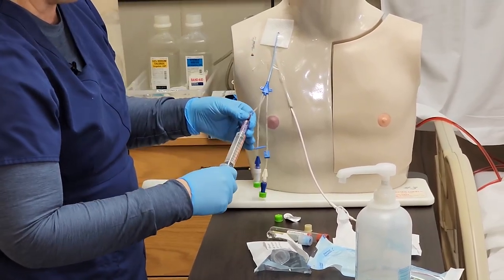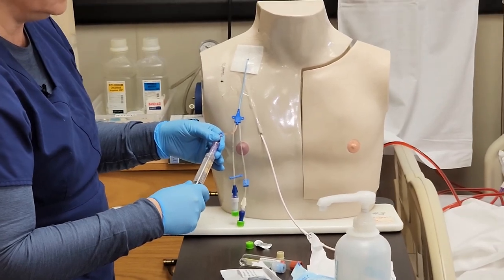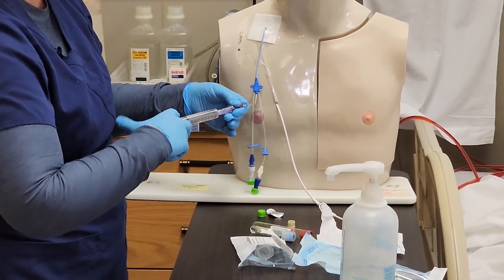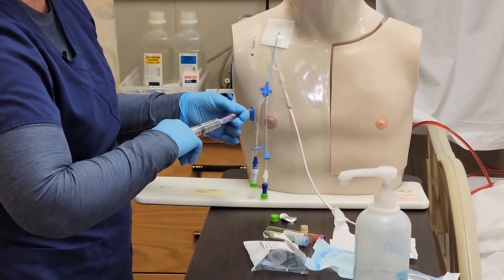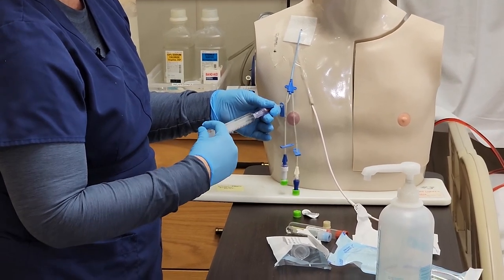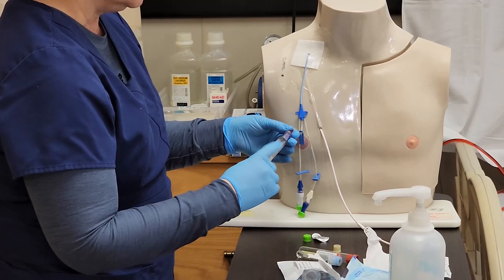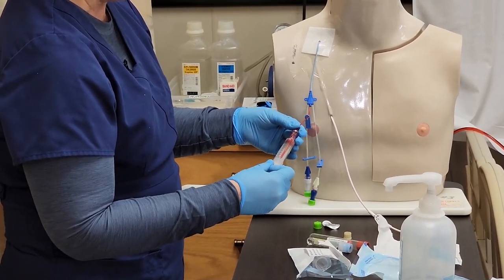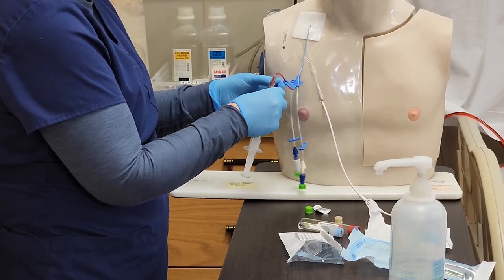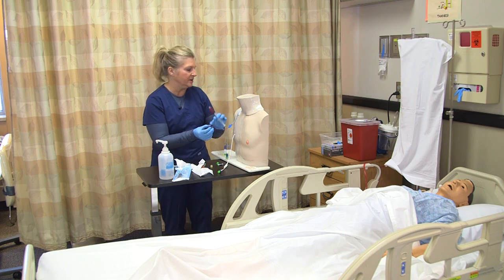I pull back and I'm getting blood return, so I can go ahead and flush with the policy-recommended amount, which is about 10 cc's. It's flushing very well and I feel no resistance — you never want to force anything into the catheter. Now I'll use the same syringe to pull back my discard blood, about four to five mls, before taking my blood sample to ensure an accurate result. I clamp before I remove that and discard it in the appropriate receptacle.